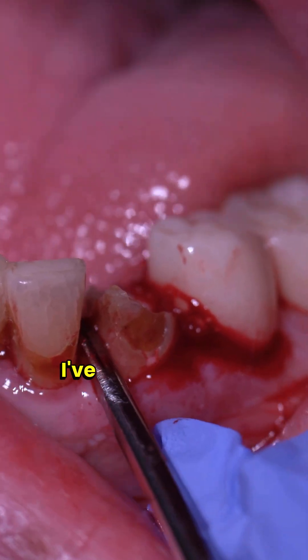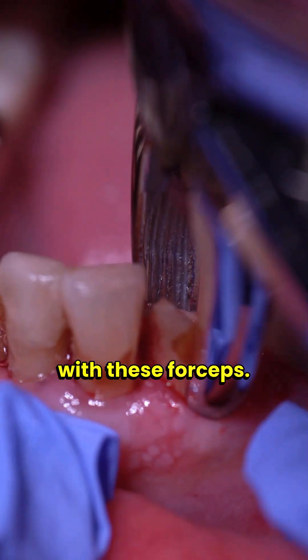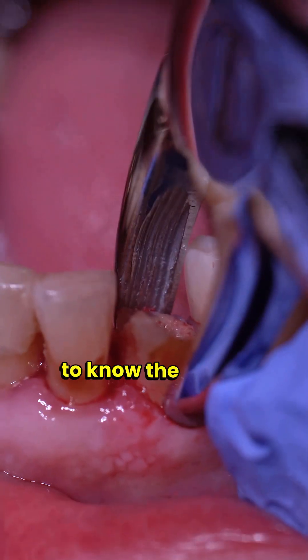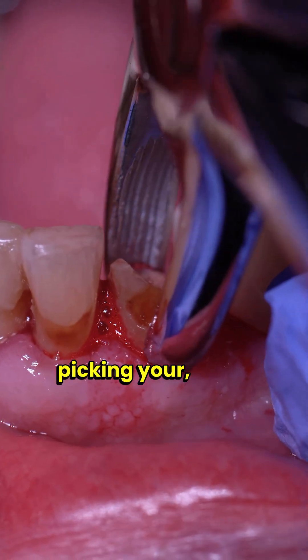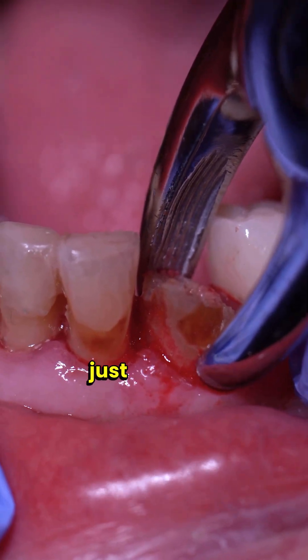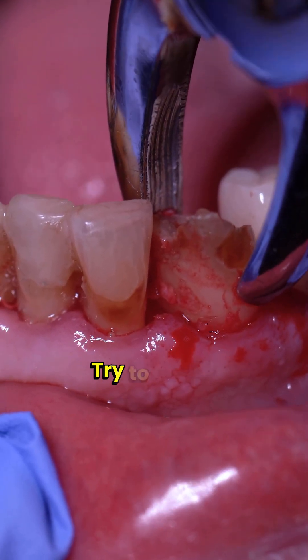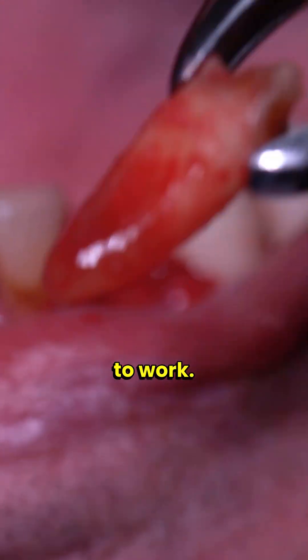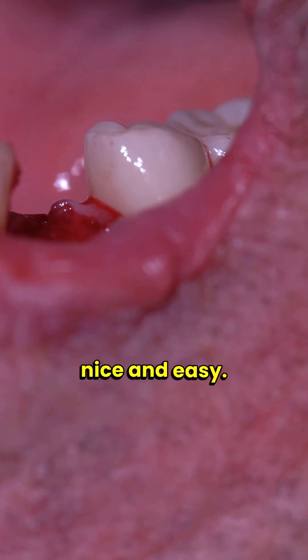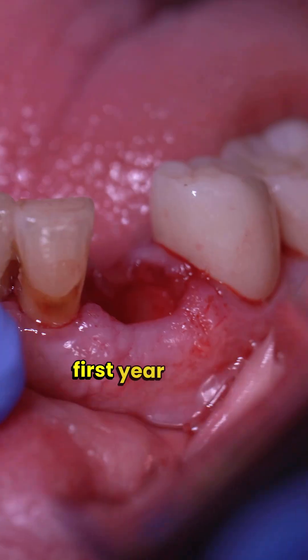I've had situations where I've accidentally dislodged a crown next door. Now that it's pretty mobile, I'm going in with forceps. It's important to know the shape of the tooth when deciding what to do with the forceps. This tooth is a cone, so you can do some rotational movement and a little buccolingual motion — rotation works great for a cone shape. You'd never try to rotate molars. There we go, tooth is out.